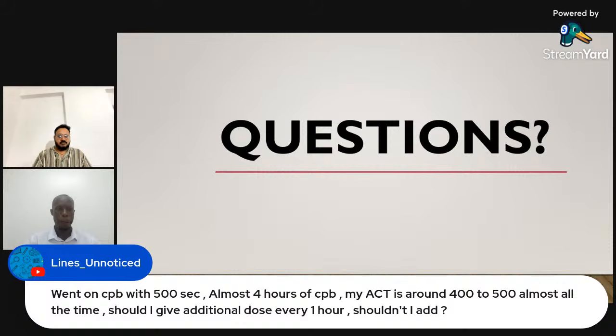Okay, we have one more question. I went on CPB with 500. I think it's the ACT, right? Yes. And then almost 4 hours of CPB, my ACT is around 400 to 500 almost all the time. Should I give an additional dose every hour? Shouldn't I add?